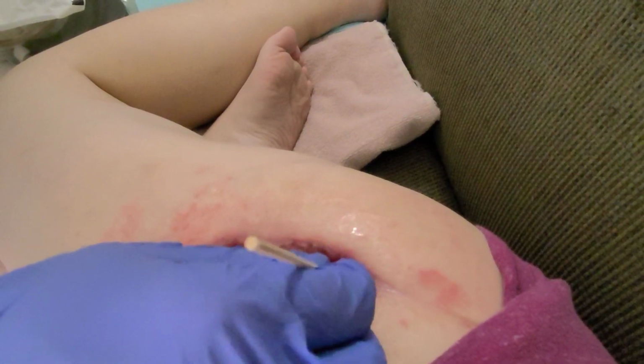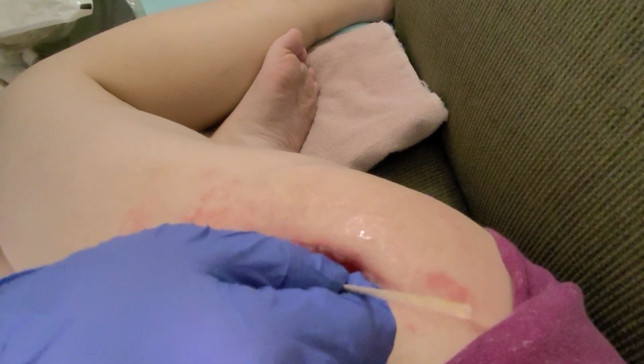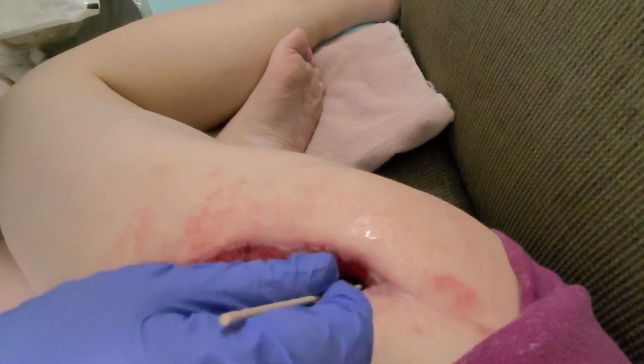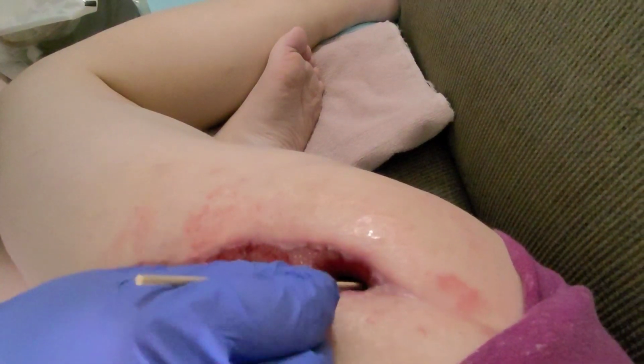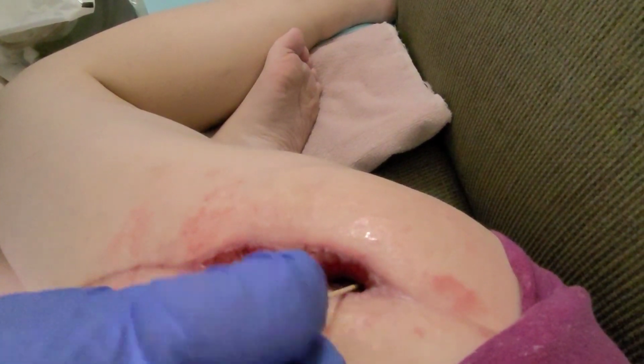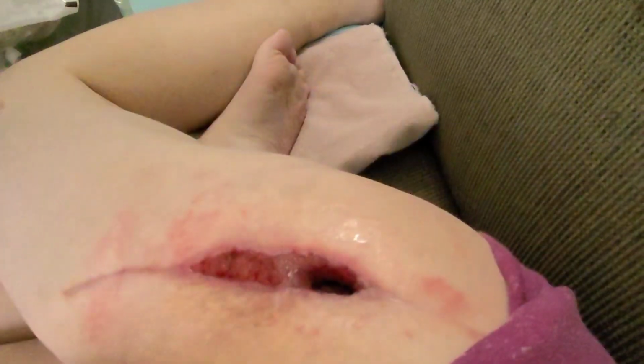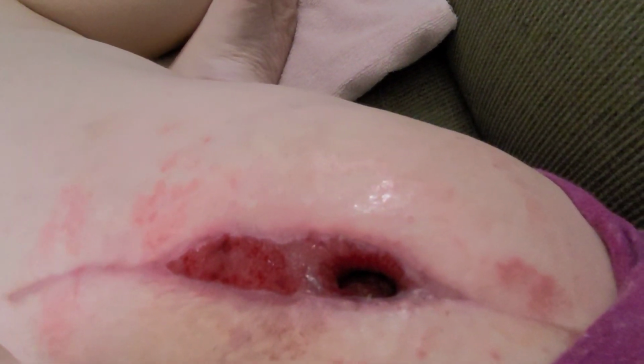She also uses these to measure how deep the hole is, because believe it or not, you guys, the wound has literally come down in size so much. You can see that scarring that looks really long. Well, the whole entire wound was opened 8 inches long, about 3 inches wide, and about 3.5 to 4 inches deep. So the wound vac has made a huge, huge difference in the way this is healing.